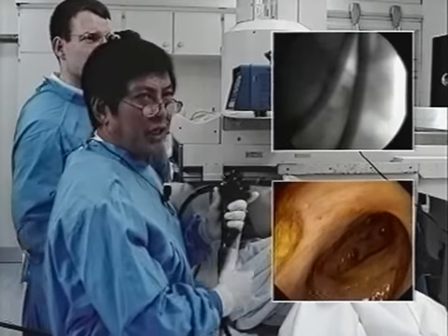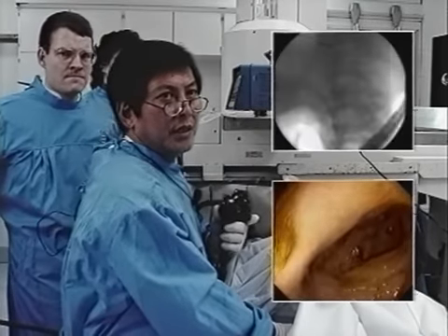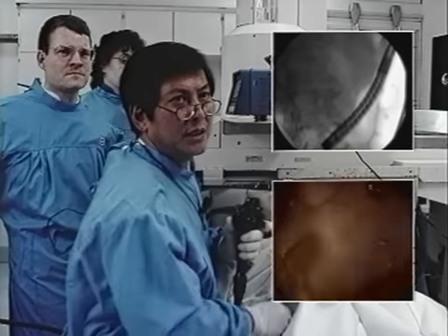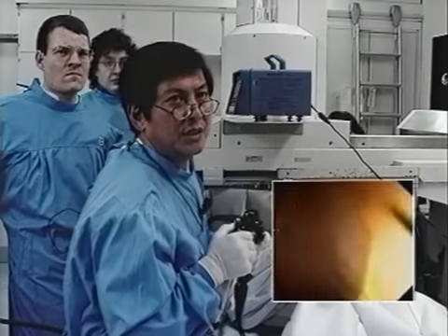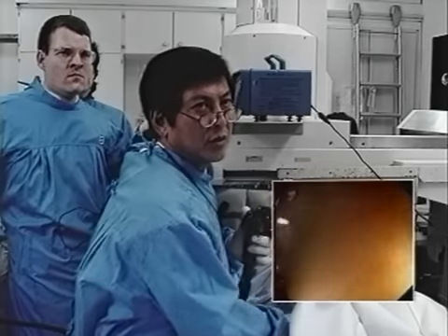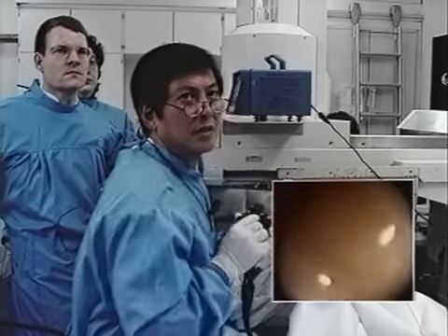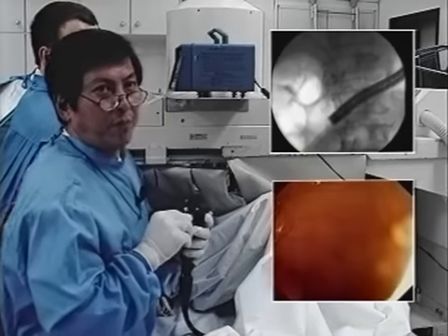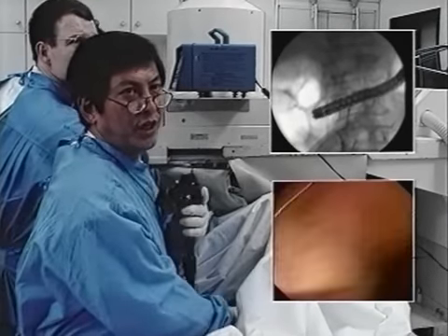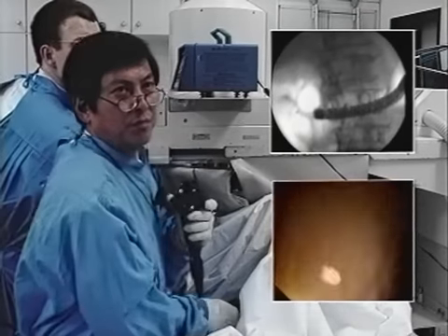By using the stiffening, we have now passed the left flexure of the colon and are approaching the right flexure — the hepatic flexure of the colon — to enter the ascending colon. We are now approaching the right flexure after passing the transverse colon, using maximum stiffening of the scope.